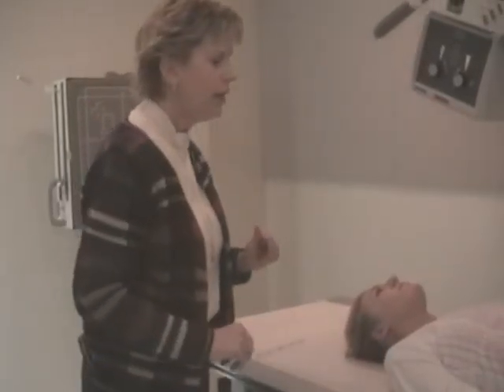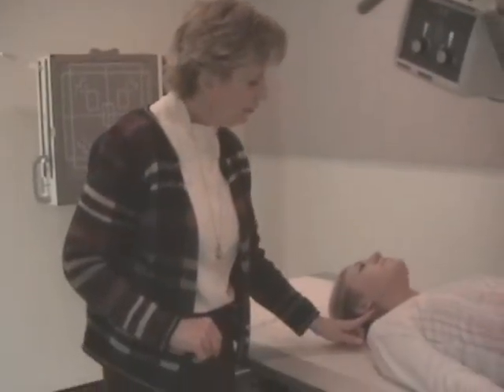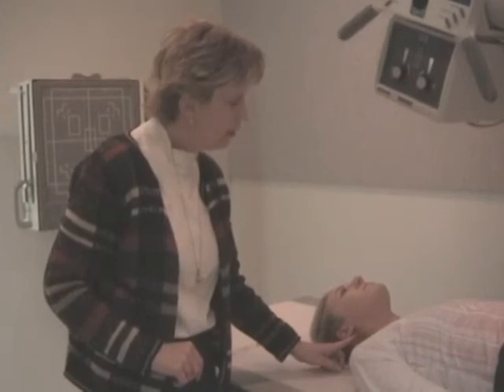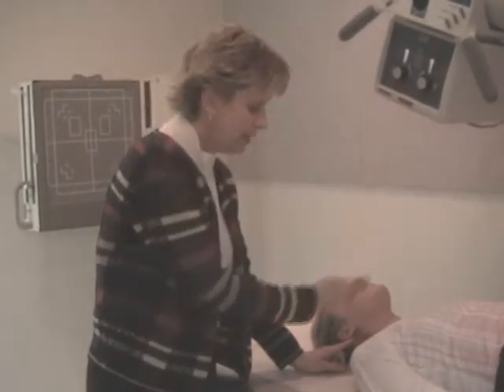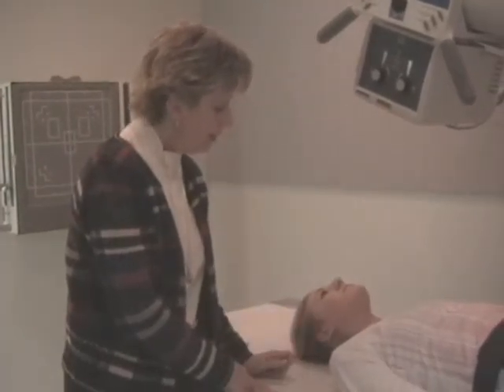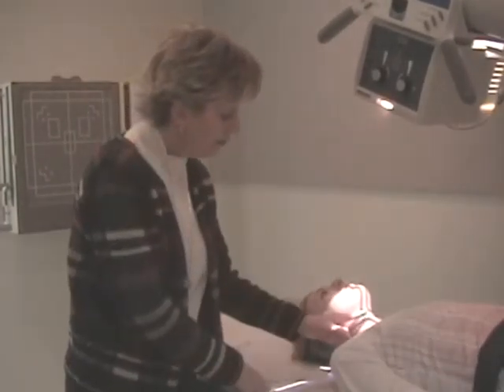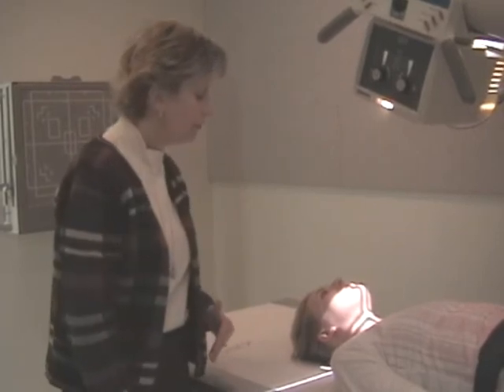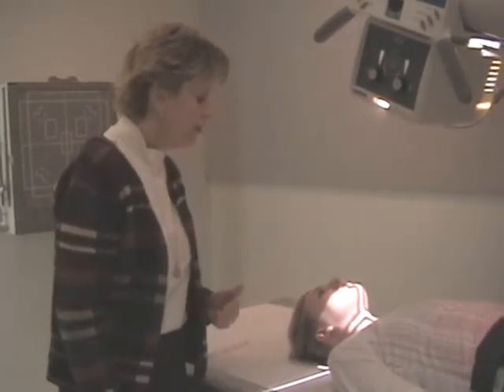Let me emphasize the main points again. You will angle the tube 15 to 20 degrees cephalic. You will align the inferior border of the superior teeth with the mastoid process. You validate that the tube is at the same angle as the mandible, and then you enter just above the Adam's apple at the level of C4, exit to the center of the film, MSP to the center of the film.